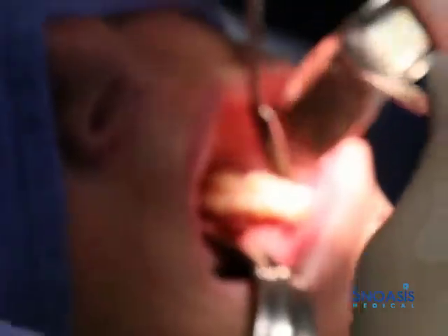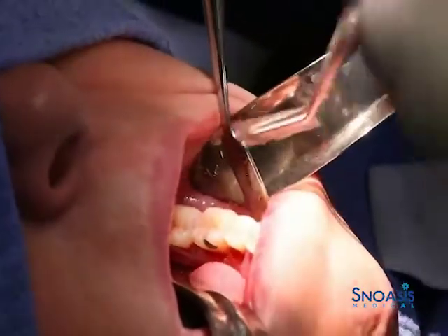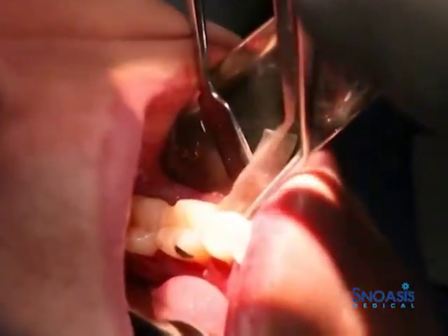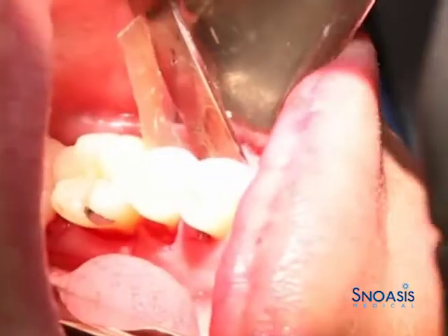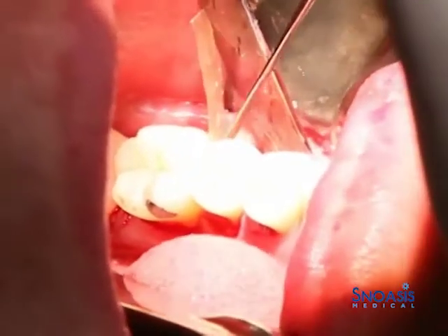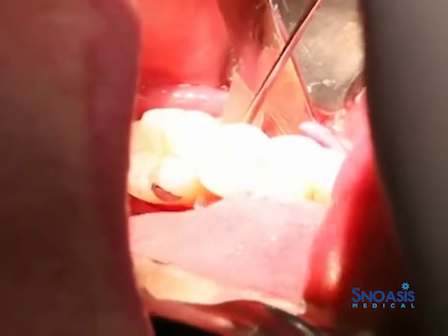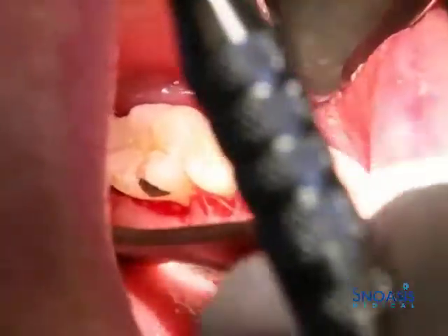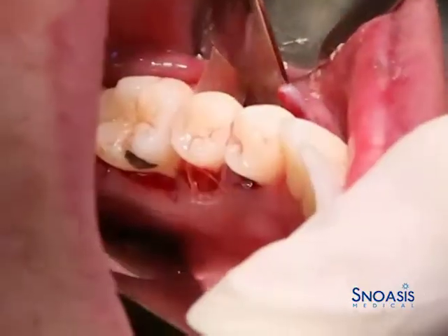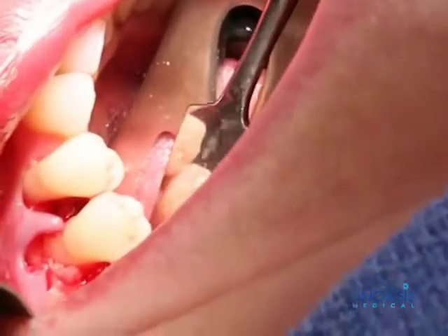Okay, so this is usually the most tricky part. So we're just going in with this nice and dry. And usually we're just going to try to get it in there a little bit. I like to take a tunneling instrument and we'll just push it through. And you can see it going in one side and coming out the other. Let me just take that on the inside here.